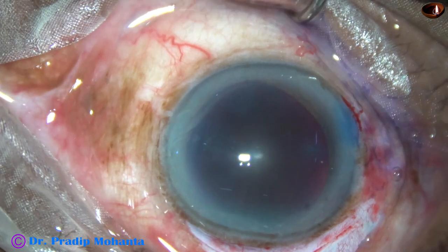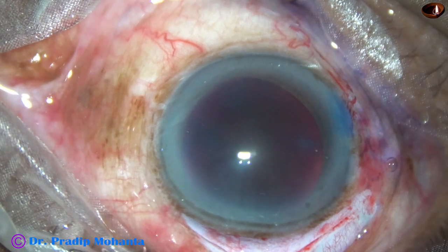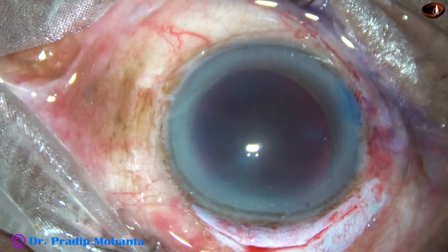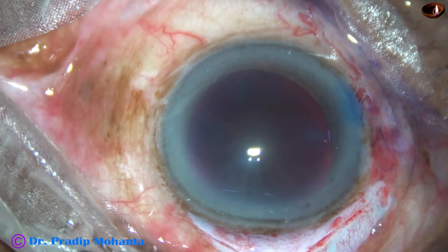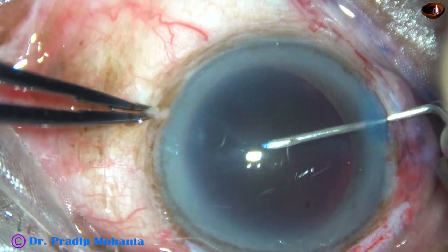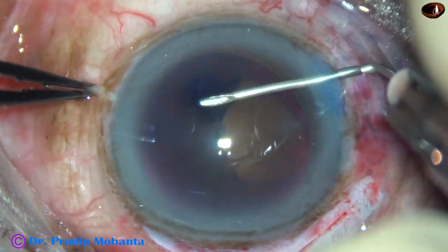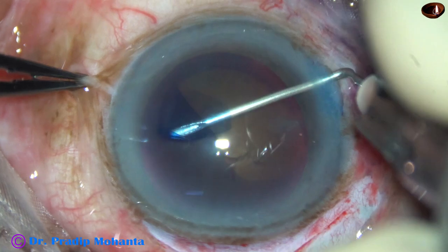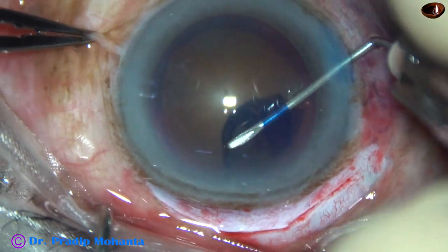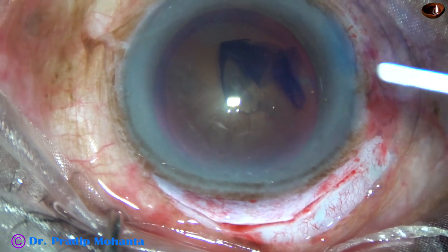And now I am going to do a large rhexis with a bent 26-gauge disposable needle. Why large rhexis? Because I am going to prolapse this big nucleus through the opening. The needle goes through the side port and conjunctiva-limbus complex is held at the limbus. A capsular flap is raised and this flap is guided anti-clockwise, and a large rhexis is done. This is a big rhexis and nuclear prolapse will be very easy.